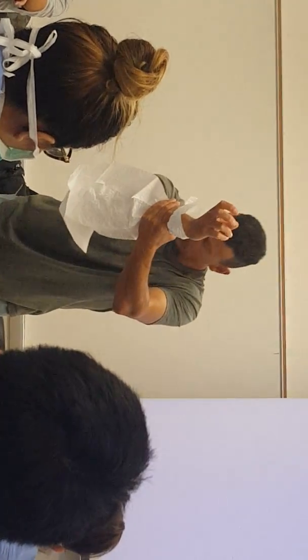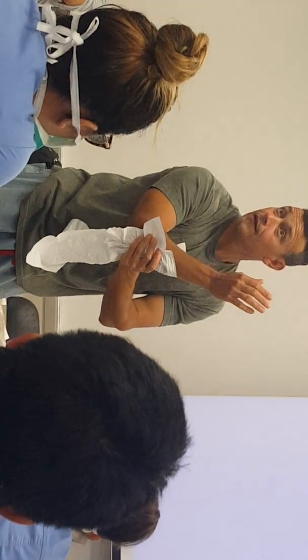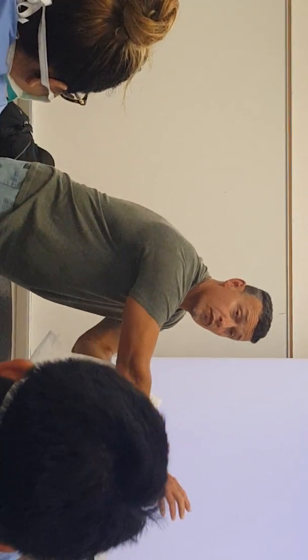There is no free. See how I'm leaning over too? That's something you guys do. Because you're so worried about getting yelled at, you forget to lean over. Get your rear in the air and lean over.